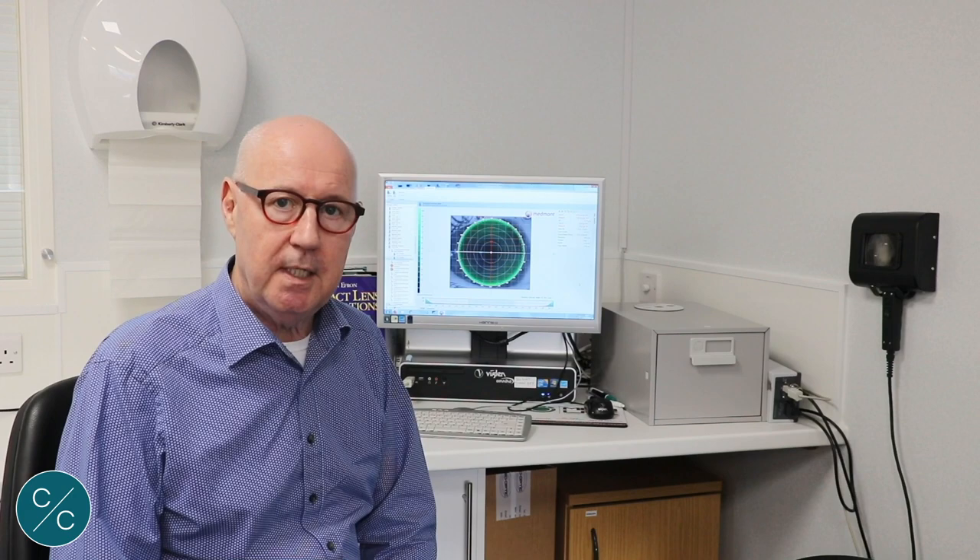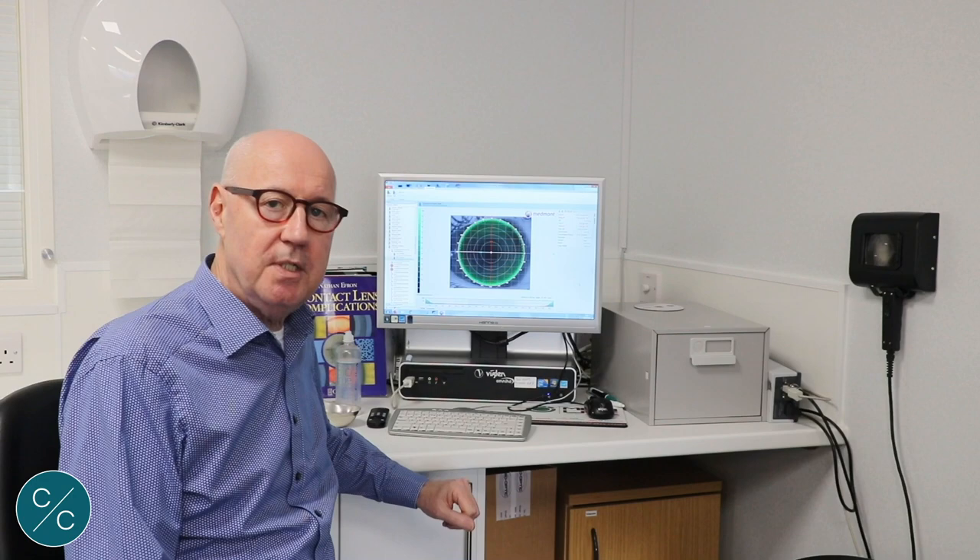Selection of the first lens is normally dictated by the manufacturer and they normally refer you to K readings. In this case we have quite a sophisticated piece of software that will actually suggest the first lens that we should try. What I'd like to show you today is that this software is suggesting that we start with an 8.10 base curve, and I'll show you that we can't rely on software alone — we really have to look through the slit lamp at the fluorescent pattern, and that's what I'll take you through today.